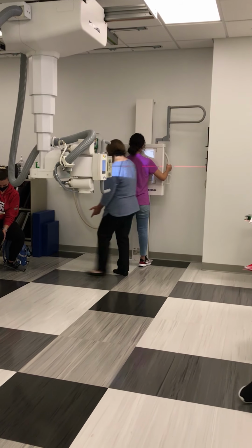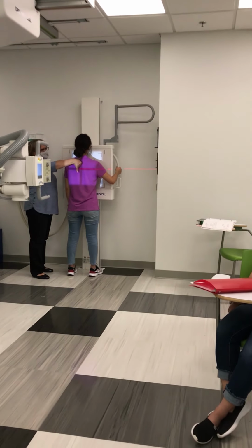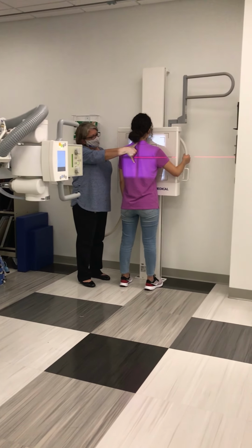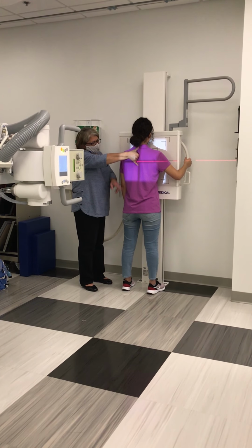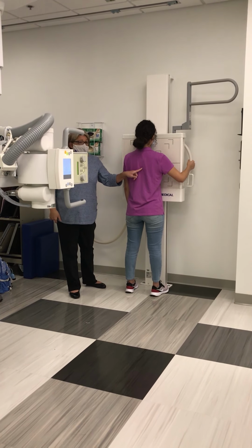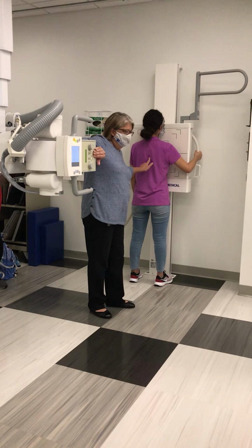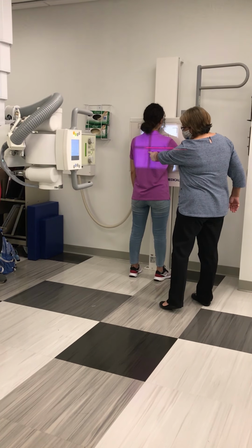How do I find T7? Well, one method that I can use is to place my thumb on the patient's vertebral prominence. That's that most prominent spinous process. Spread my fingers apart, and my pinky is here. That should be approximately T7. Now these are landmarks that you use, and these are guidelines. So I'm going to bring my tube down to that level.